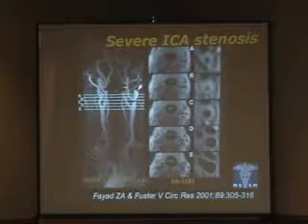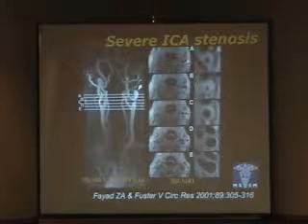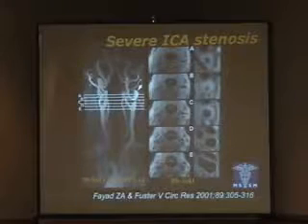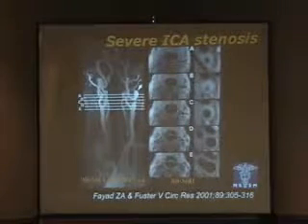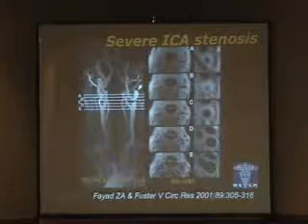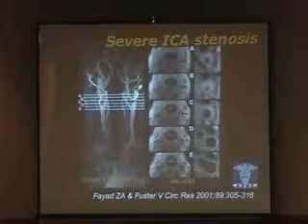You can get the percent stenosis very accurately, but on top of that you can add the vessel wall imaging, where you can look specifically at the wall itself. So combining these two together provides really a lot of information from the stenosis point of view, which especially in the carotid is obviously very important, but also on top of it you can look at the vessel wall itself.